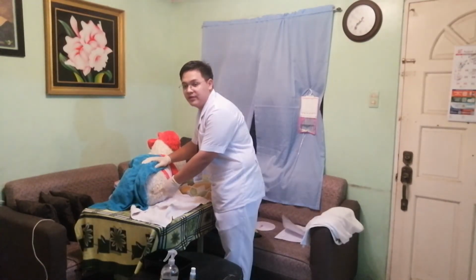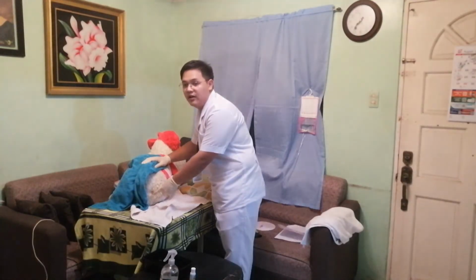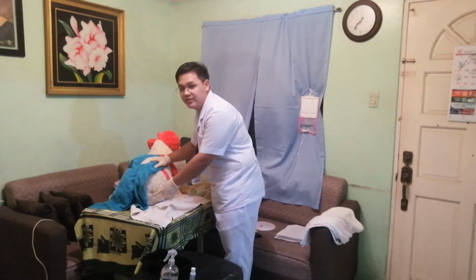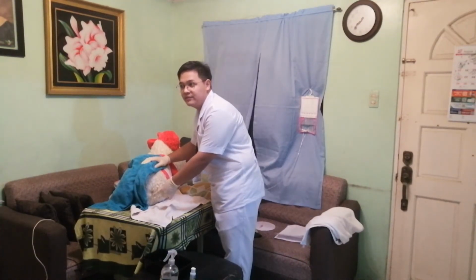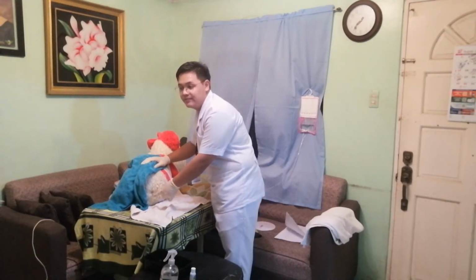And also, we will be checking the tube for any blockage of feces. So if there is a presence of a blockage to our tube, we will need to flush it and we will redo our procedure. Okay, so for example, we have not encountered any blockage. Our next step is to insert it again.